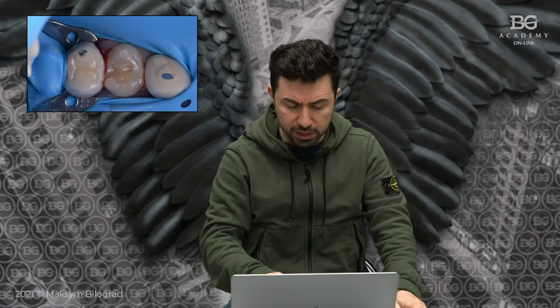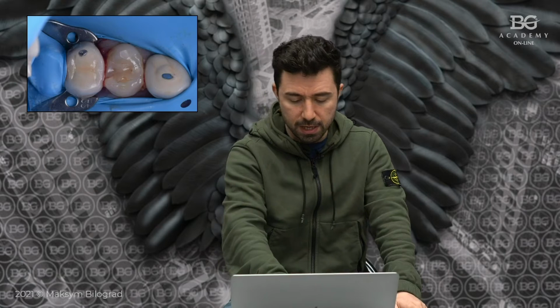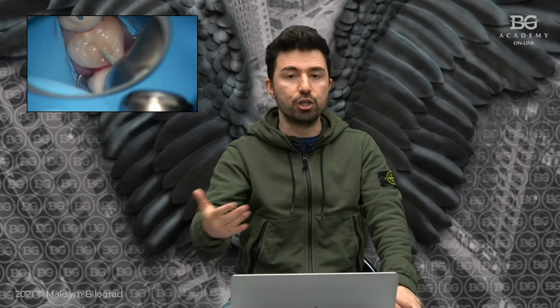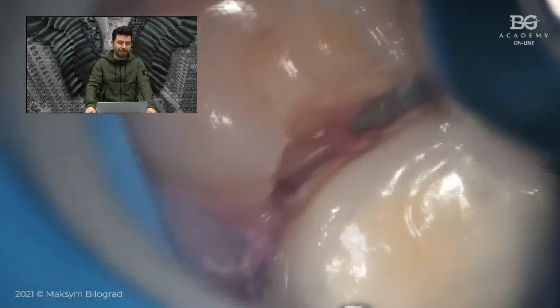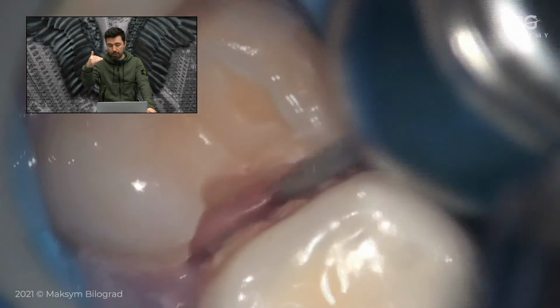Why we do this split dam? Again, for our comfort. With this split dam, we can actually do our restorative part. We can remove caries defect, we can do our preparation. In this case, we decided that we will do indirect restoration like veneer-lay, for example. Buccal involvement and necessity to do cusp reduction and cusp coverage.